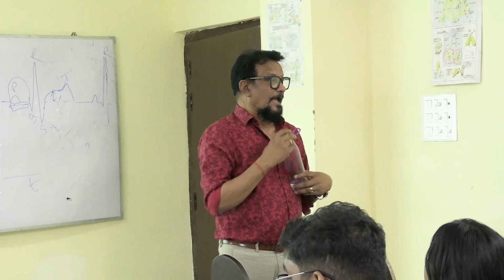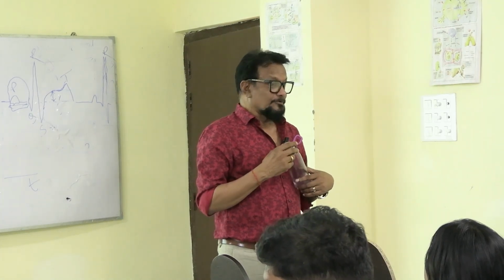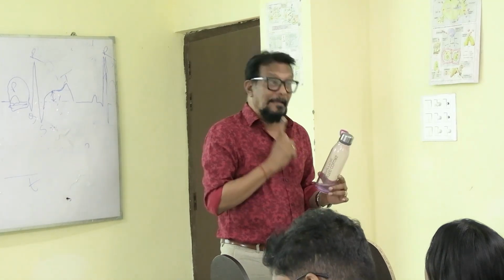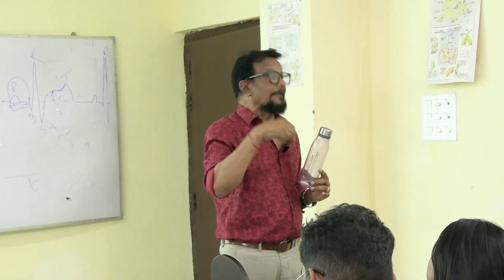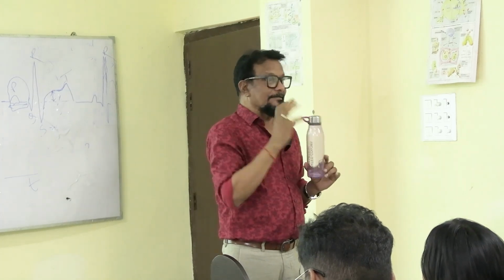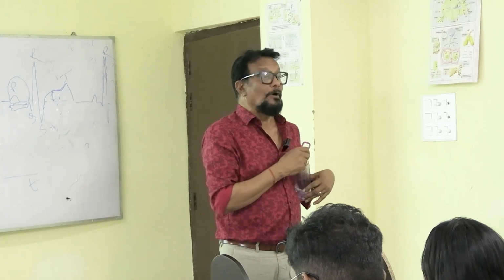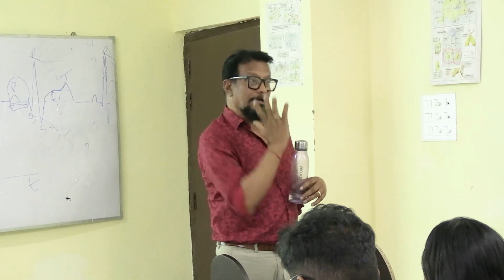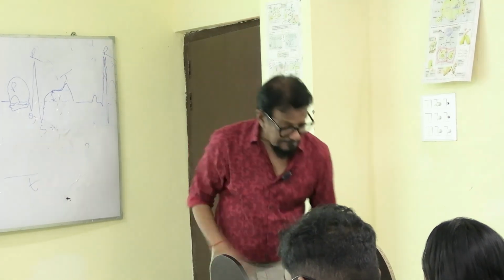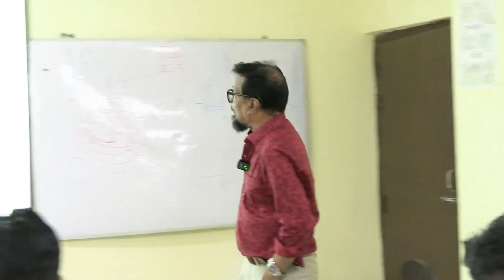Because of this hypertrophy, there may be axis deviation, so we can determine the axis also. When we find changes in the wave that reflect the heart is hypertrophied, we are interested to know the axis of the heart, what is the orientation of the heart.